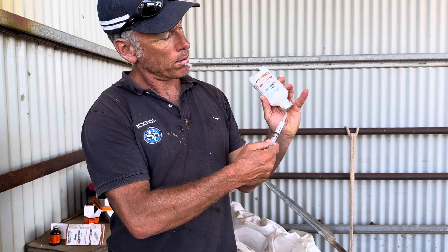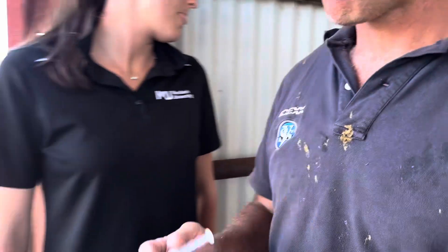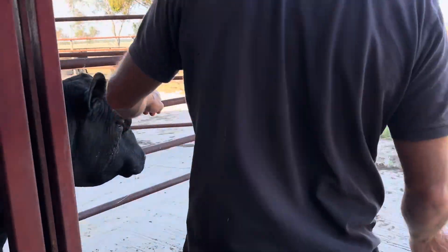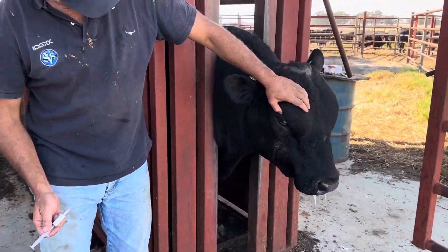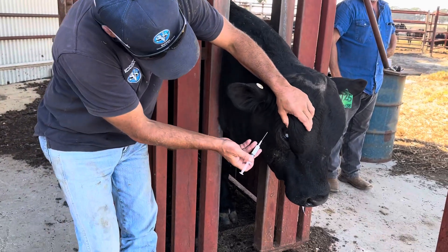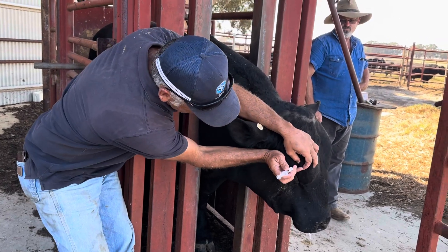Now I've got three mils. You can put them mixed together. Come on over here and check this out. So what we're going to do is put it in that subconjunctival space. Some people try to poke it up under the eye, but what works really well is to poke it through the actual eyelid itself.